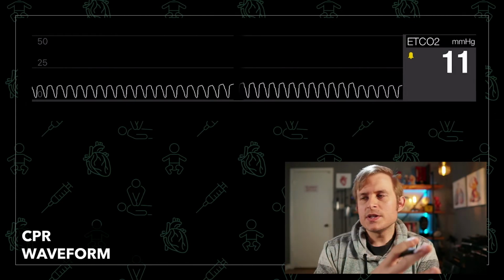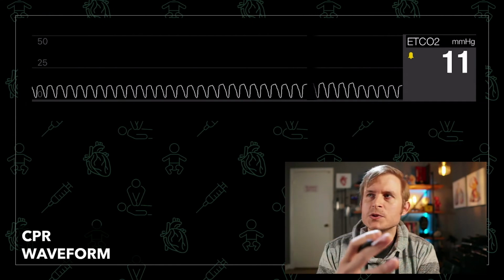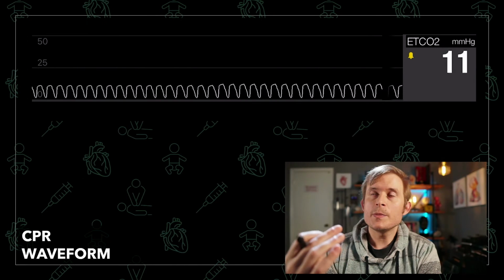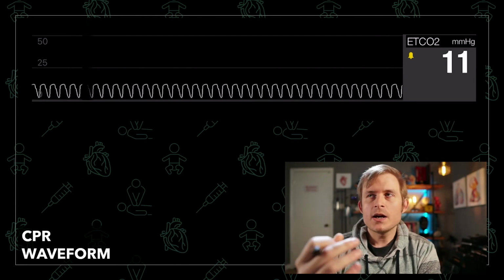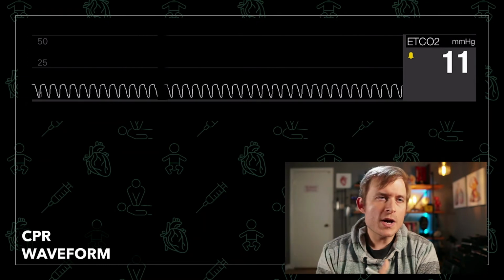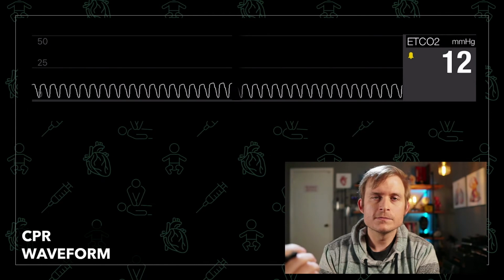You'll notice too that the value of end-tidal CO2 varies between 10 and 12, and this is because your providers may be becoming more fatigued. And this is normal as long as you're keeping it within that 10 to 12 range. If you start to drop below that, this is time to consider switching a provider off.